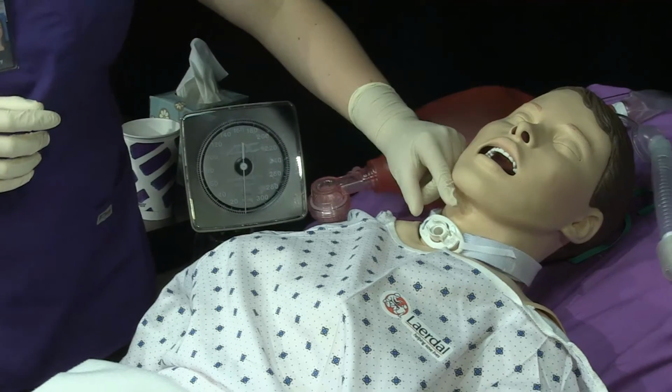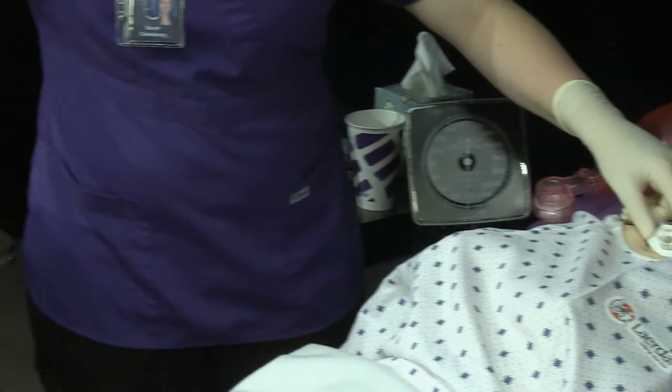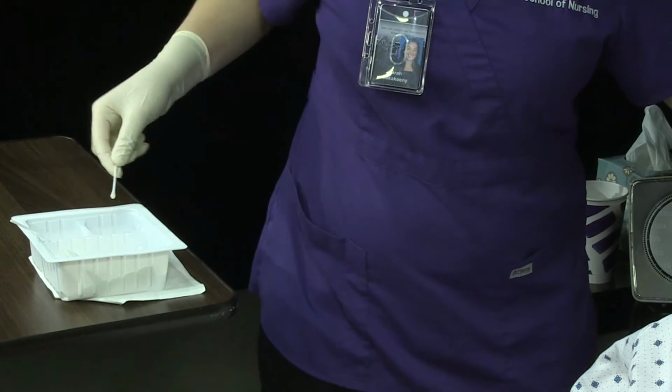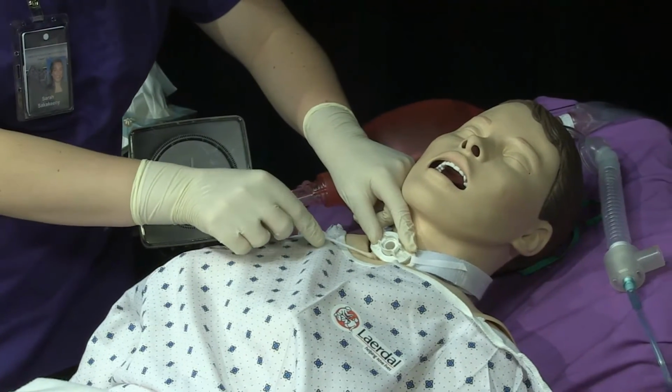Use the clean hand to stabilize the tracheostomy. Dip sterile cotton swab in saline solution and use a new swab for each swipe.